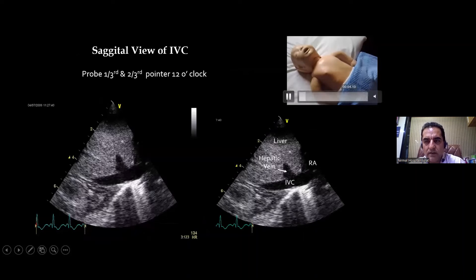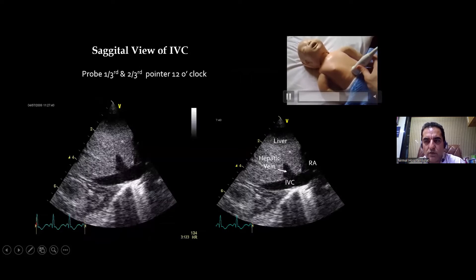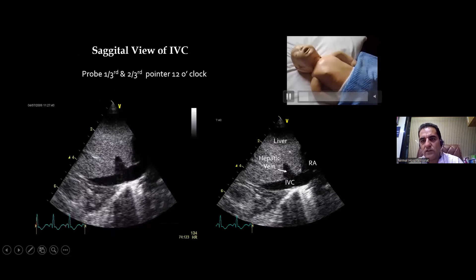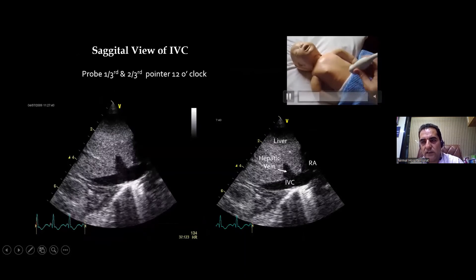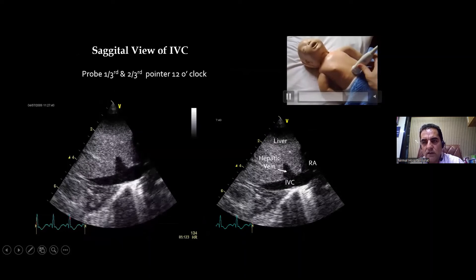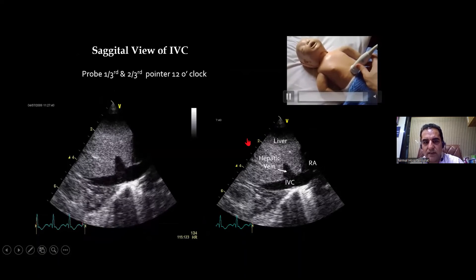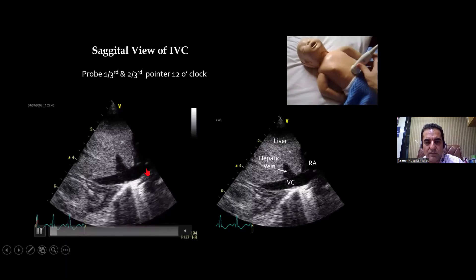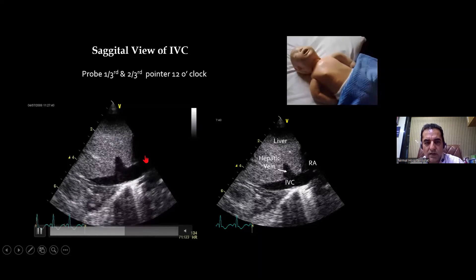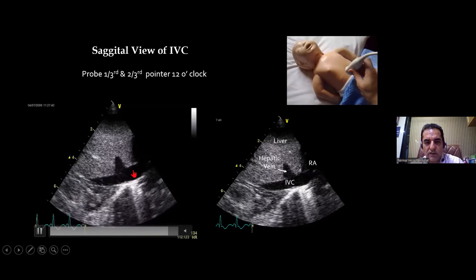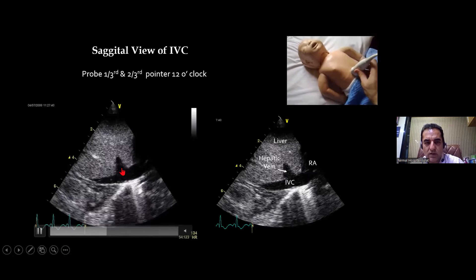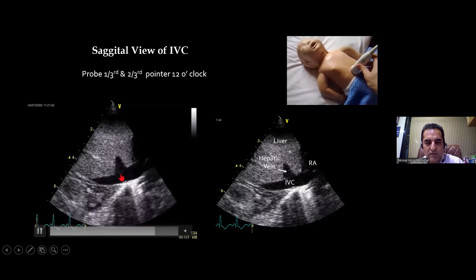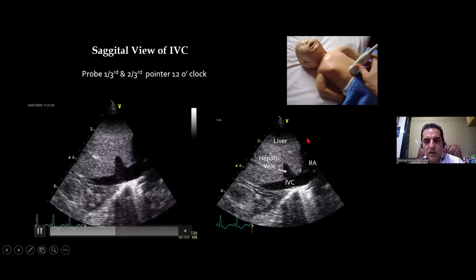Now the pointer is pointing at 12 o'clock position instead of 3 o'clock. It is swept towards the right side. What would I see? I would see the IVC. This is my IVC through the liver entering into the RA — the characteristic feature is it fans out. And this is your hepatic vein, which is joining your IVC.